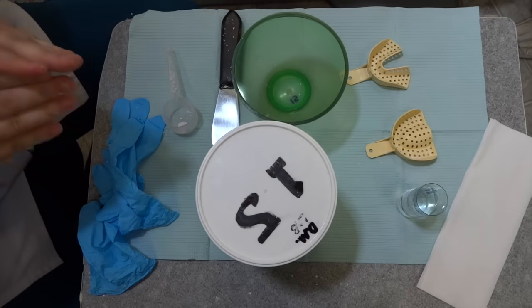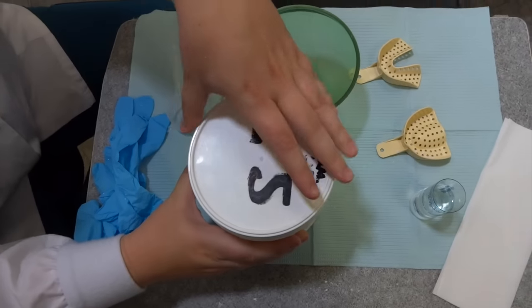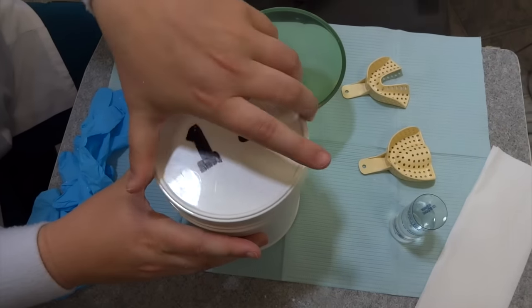The first thing you want to do before you even put your powder out is to fluff your powder. Just flip the container over once or twice. That'll help fluff it and make a better consistency.